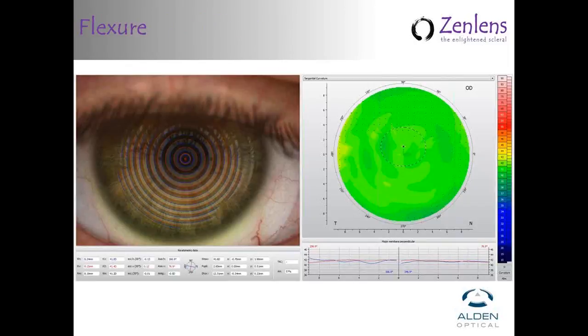If there's not flexure, and I think this would be an example of a situation if there's no lens flexure, you do topography here and you can see there's no obvious bow tie or signs of cylinder running through here. This would be a case, it's probably lenticular cylinder, and we would do a front toric design which is simply stabilized by the dual thin zone dual elliptical stabilization system, and that's been working quite well. It just basically becomes essentially the same as fitting a toric lens in that case.